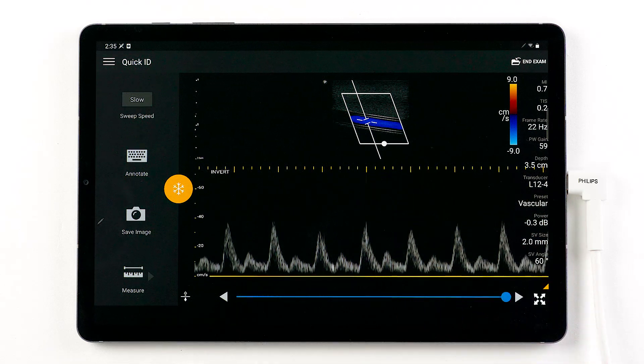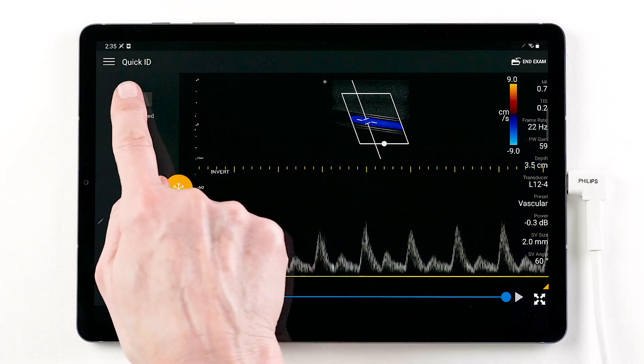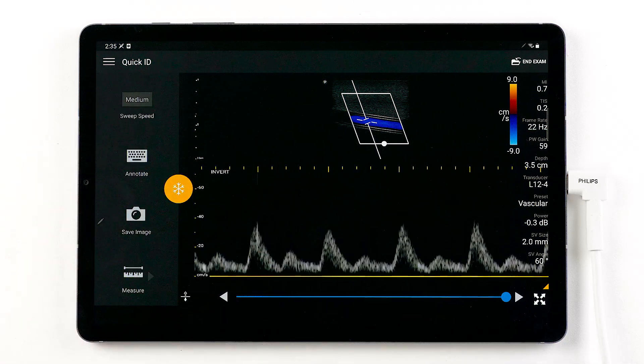Post-processing capabilities include baseline, sweep speed, and inverting the waveform.